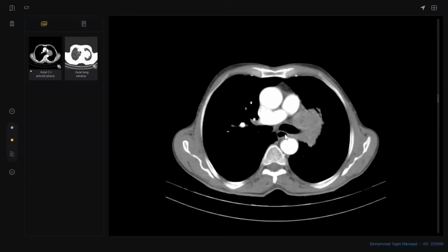What is the most important next step you will recommend in your report? So the next step in this case is esophagoscopy to check. But it is lung carcinoma, so then bronchoscopy is advised. Before bronchoscopy, look at the image and tell me, please.